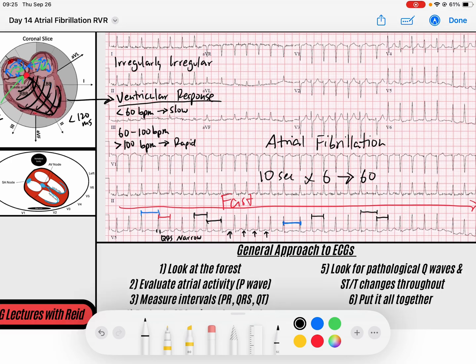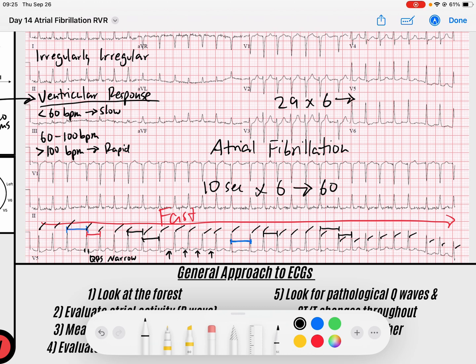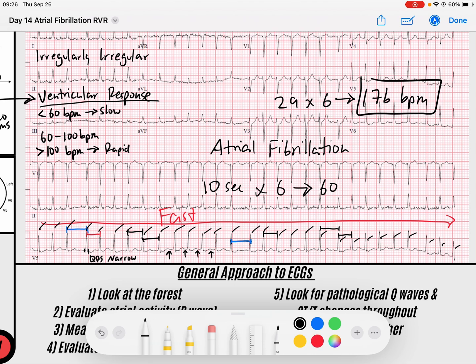Counting through the beats in this 10-second strip, I get 29 beats. Twenty-nine times six — let me use my calculator — gives us 174 beats per minute. That is really fast. So we certainly have a rapid ventricular response. We would say this is AFib with a rapid ventricular response.